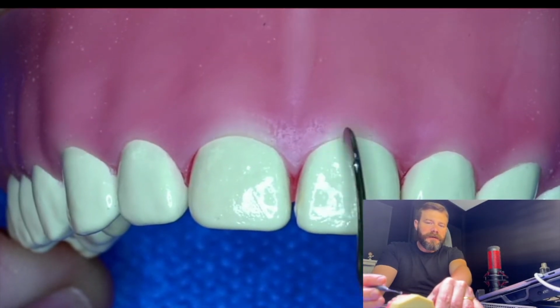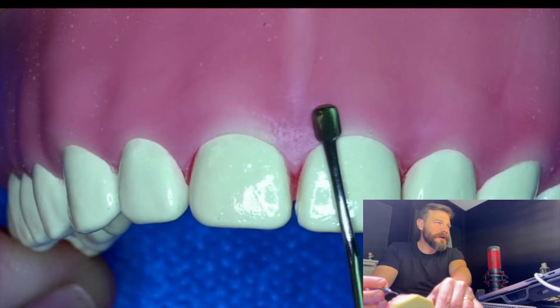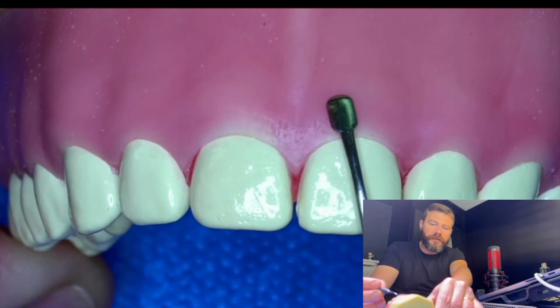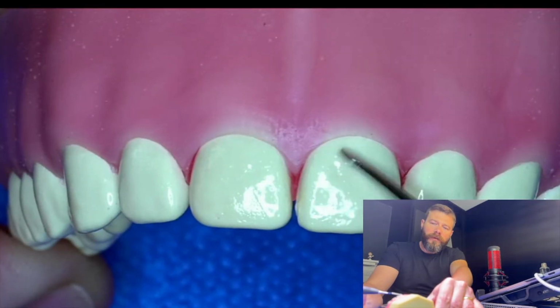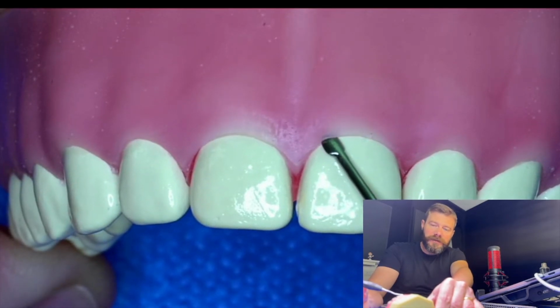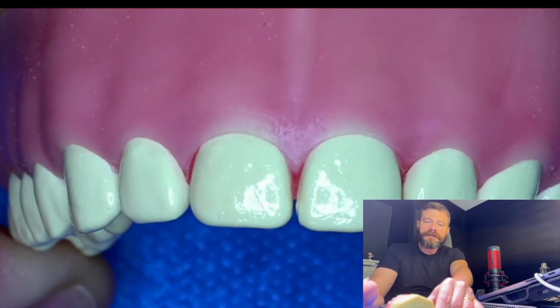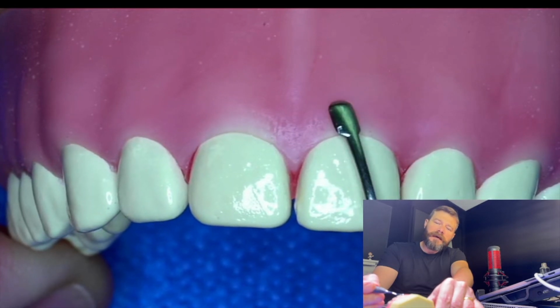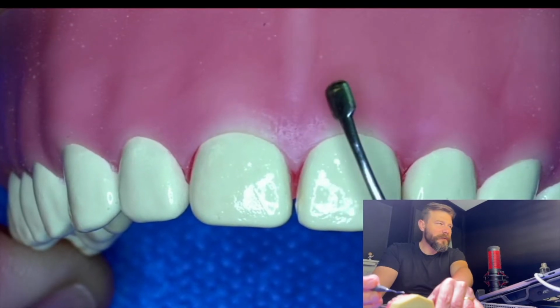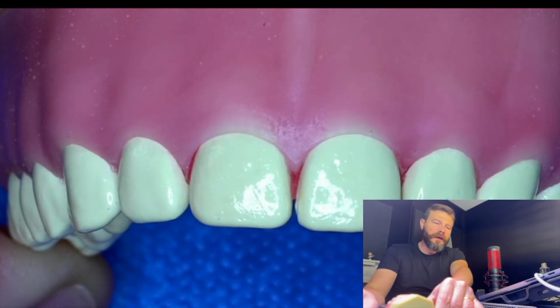The second tunneling instrument that I did not talk about yet is this slightly larger one. It is basically the same design as the previous one, but a little bit larger. Why is that? It is more delicate for starting the sulcular area on different occasions, and also for tunneling on the lateral incisors or lower incisors. In regular size teeth, this tunneling instrument is going to be a little faster for us to do the job. I'm going to talk a little more about this instrument in a while, okay? But they have basically the same curvature.